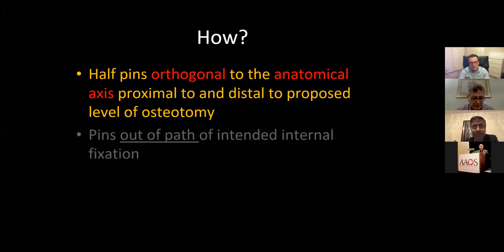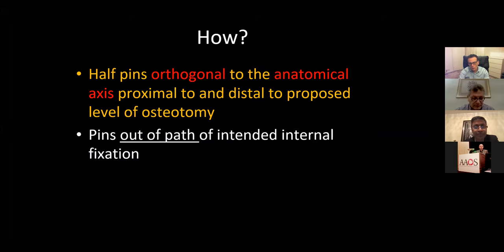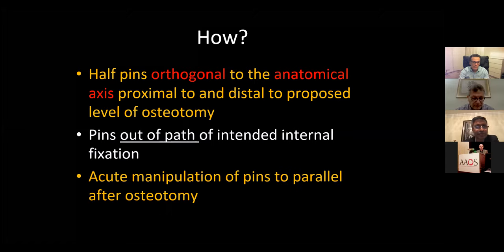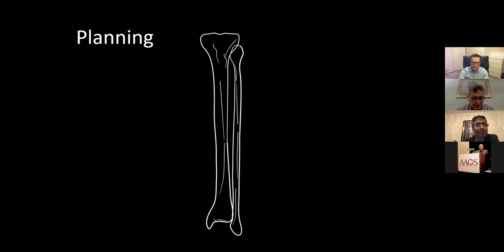axis. So it is important, obviously, that our pins are placed outside of the path of the intended internal fixation. So we don't want the half pins to interfere with the placement of the nail or the plate. And ultimately, to perform an acute manipulation of pins to make them parallel after the osteotomy. I will show this in a graphical mode.